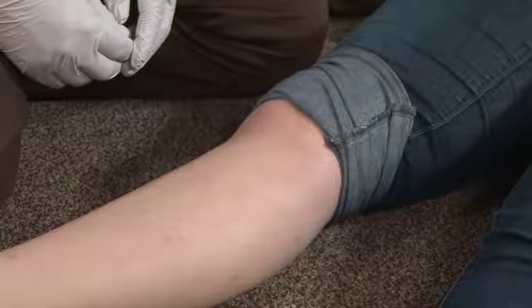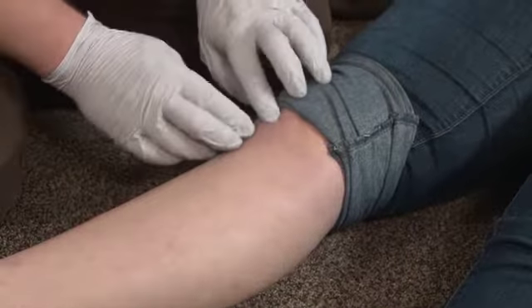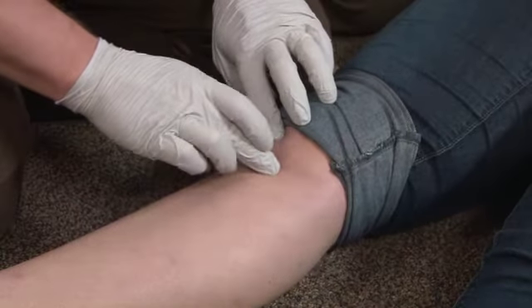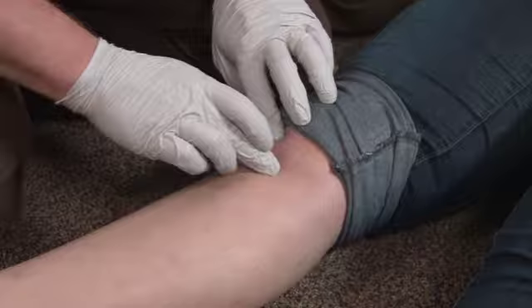The choice of insertion site may be the anterior tibia or the sternum. The anterior tibia is used in both adult and pediatric patients. The sternum is used only in adult patients.